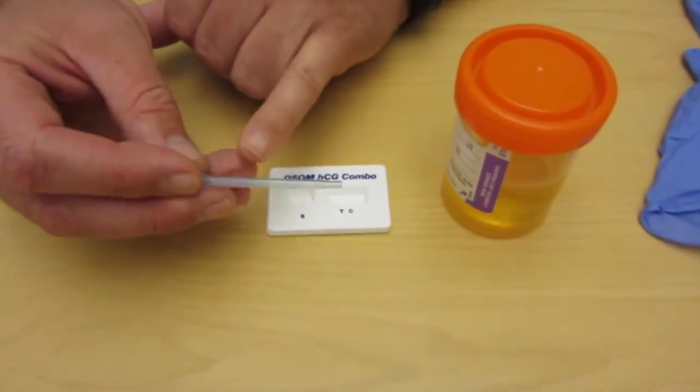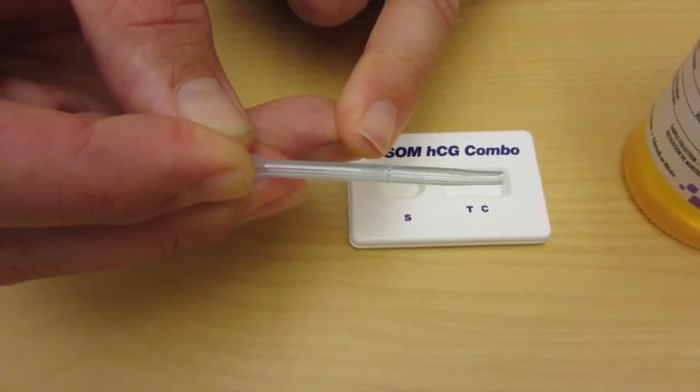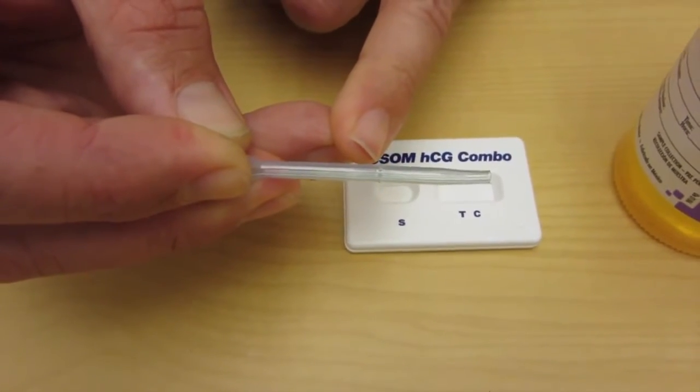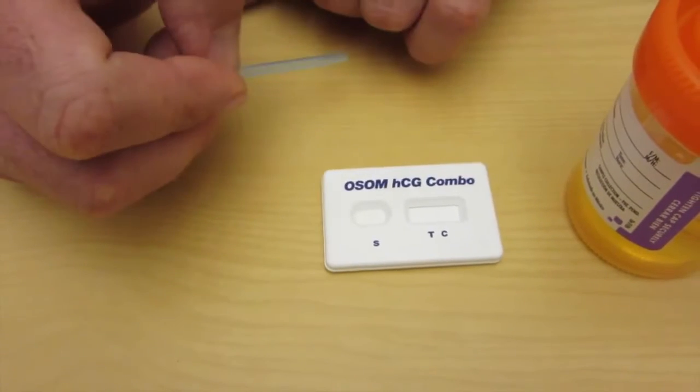And take a look at this pipette. Hopefully you can see this, but there's a small hash mark right there. Basically that's your fill line. So when you dip your urine, you're going to fill up to this hash mark and then you're going to introduce that into the sample well. Then you're going to wait for three minutes to see what your result is.